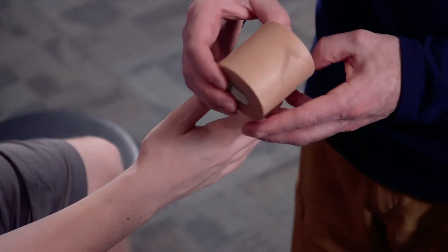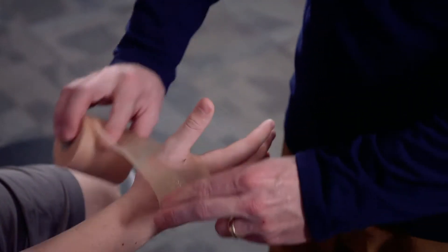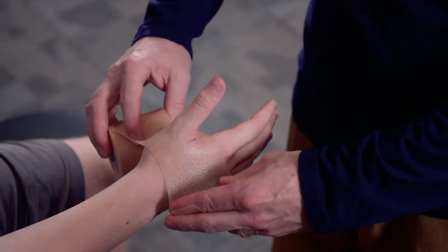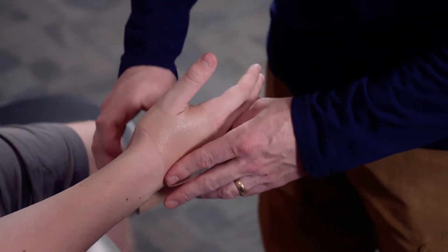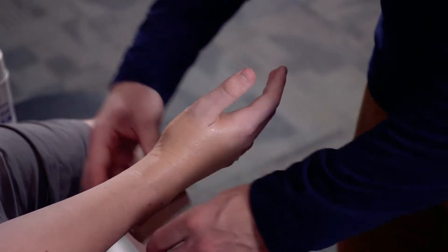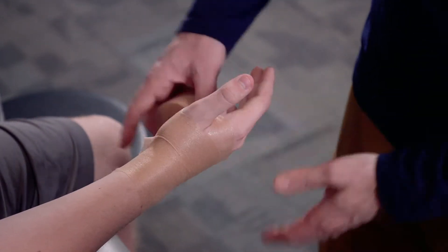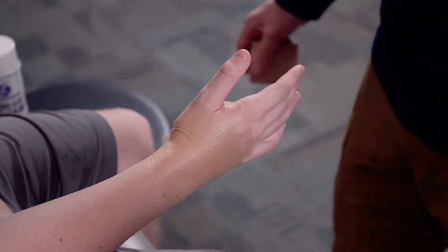We're going to take our pre-wrap. We're going to place this directly over the thumb and just kind of push down so that we can secure our tape. We're going to come around the wrist and we don't have to go too terribly far down on the wrist, but just make sure again that there are no significant wrinkles.